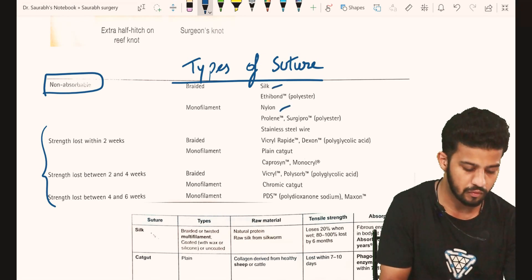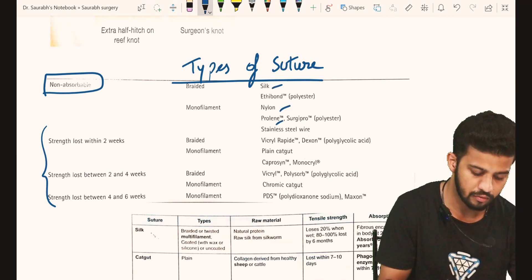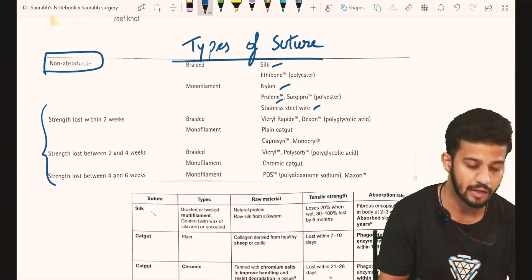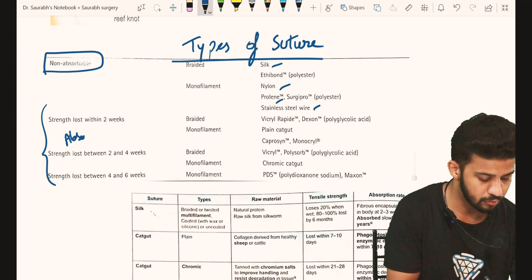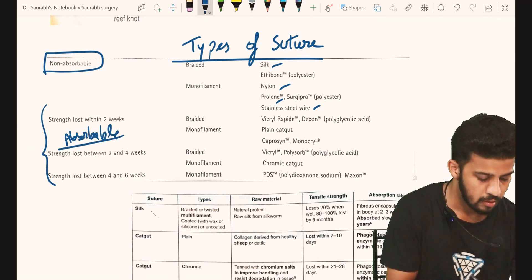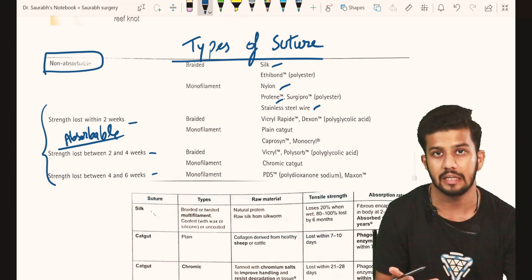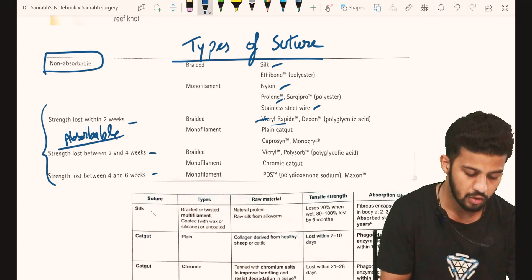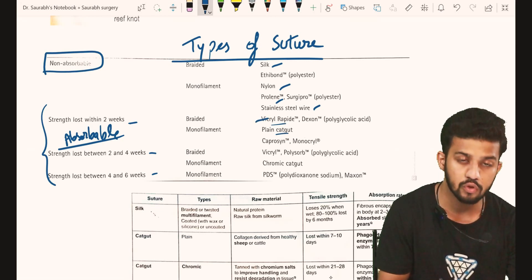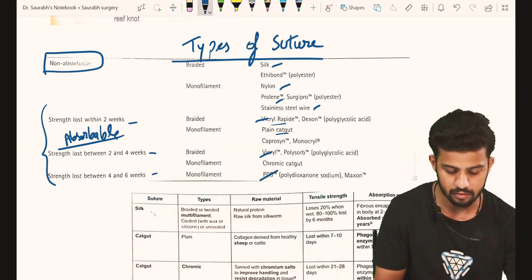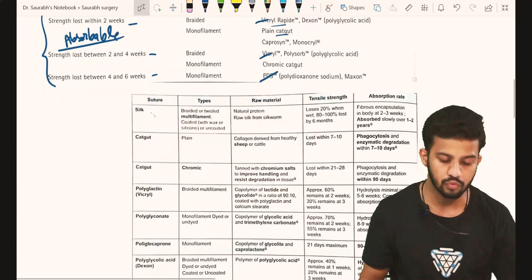In the non-absorbable category, we have silk, nylon, and we mostly use prolene. Sometimes stainless steel wire is used in cardiac surgeries. In the absorbable sutures, they are classified according to the loss of tensile strength. We have Vicryl Rapide, catgut (which we don't usually use nowadays), Vicryl, and PDS. These are the absorbable sutures we have.